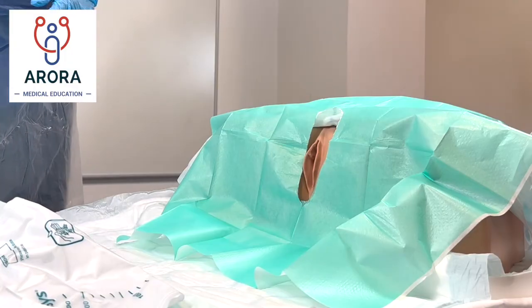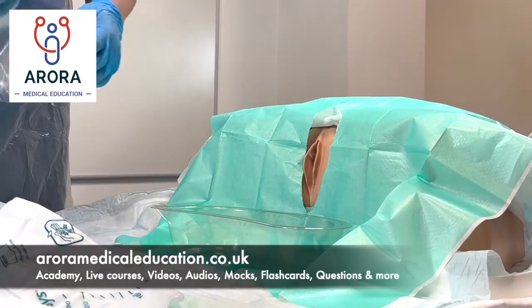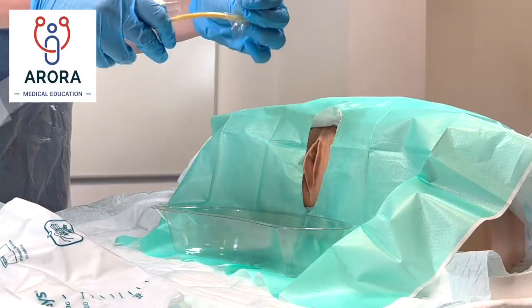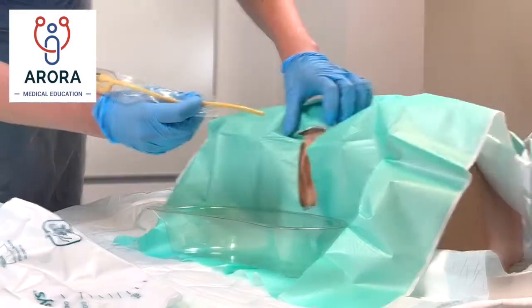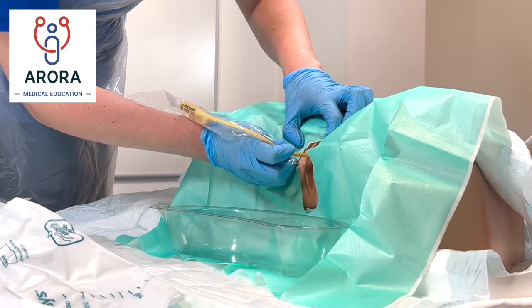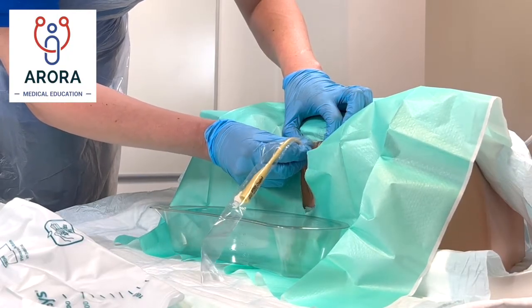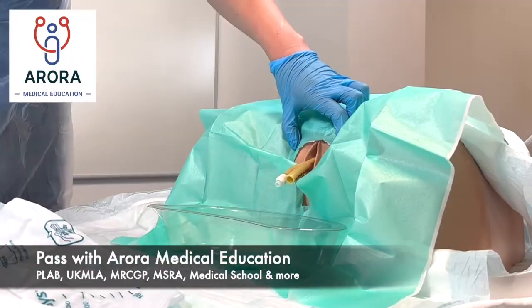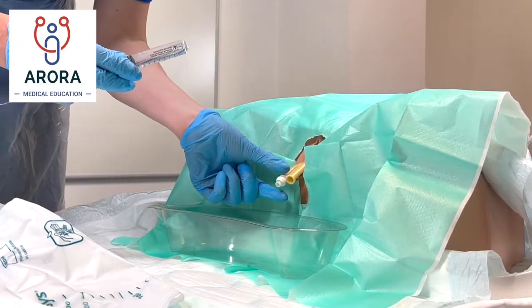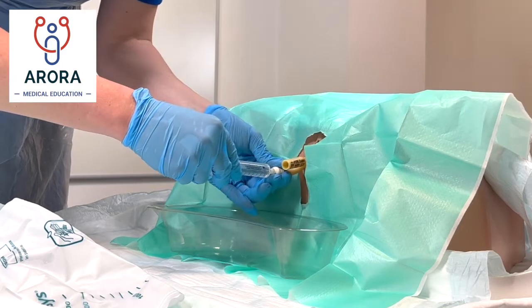'Okay Mrs X, we're ready to insert the catheter now. I'm just going to put this little bowl here to collect any urine and we're ready to insert the catheter. I'm just going to insert the tube now — let me know again if it feels uncomfortable or painful at any time. I'm just going to insert some water through into the catheter to keep it in place — let me know if this feels painful at any stage and we'll stop.'